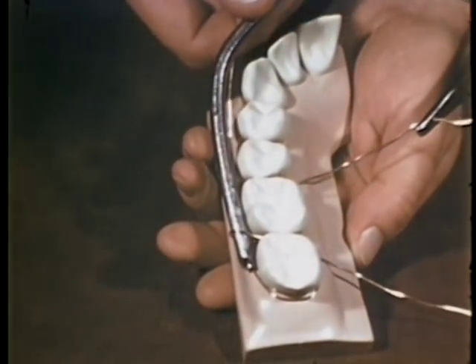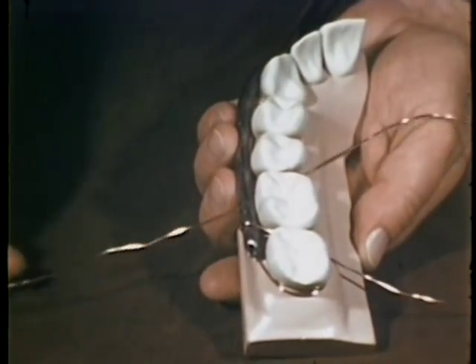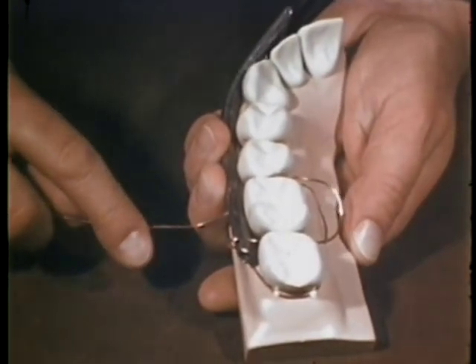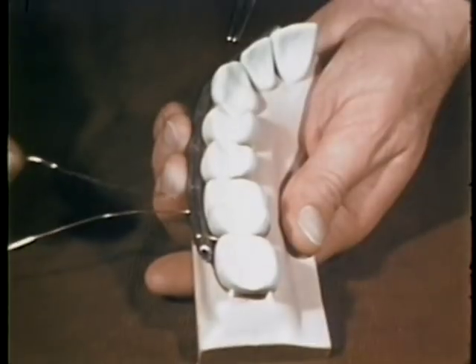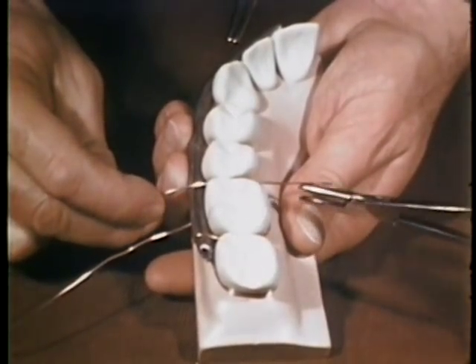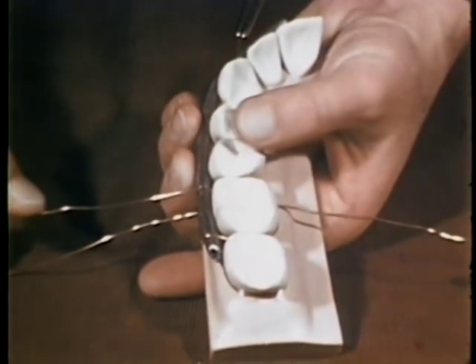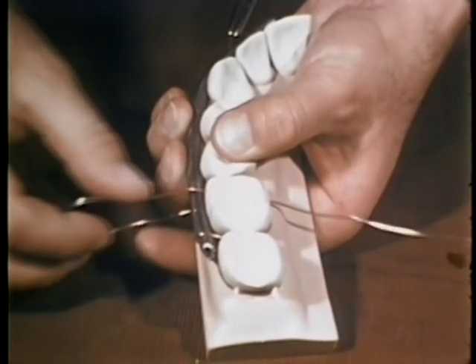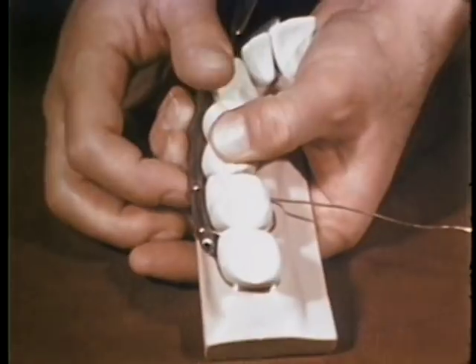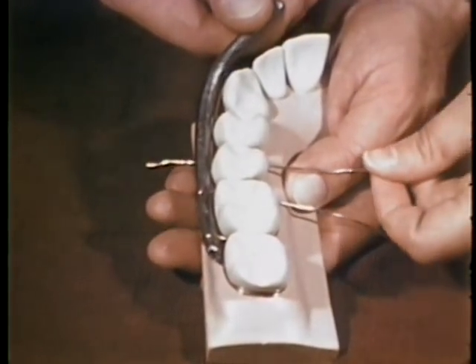The working end, or long end, which is used to form the loops, is now carried back through from palatal to buccal, under the horizontal wire and solder. It is then returned to the palatal aspect over, or occlusal to, the solder and horizontal wire. The same procedure is repeated through each interproximal space.